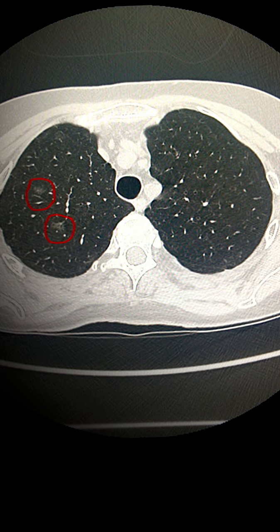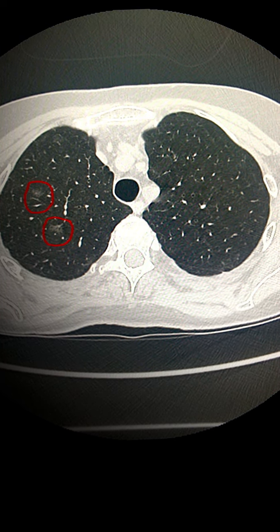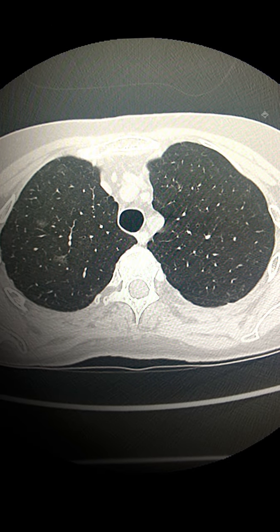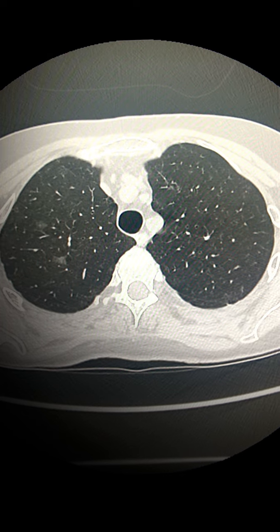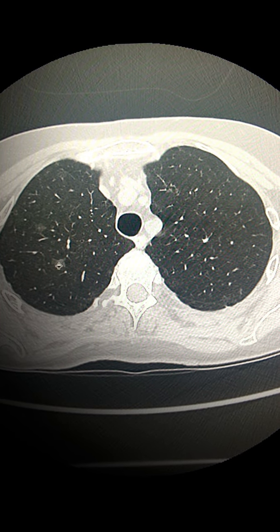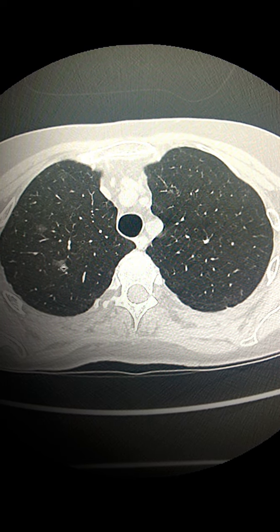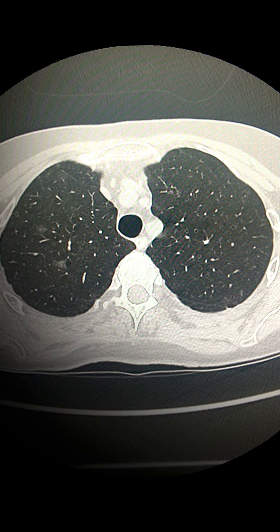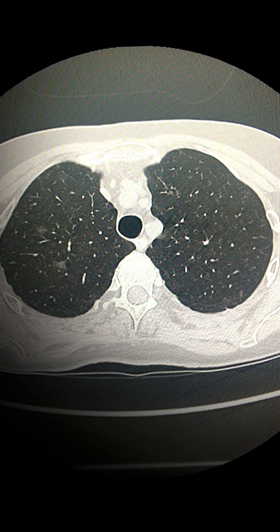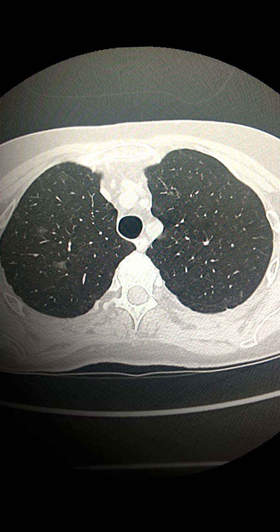The first thing to evaluate is whether they are truly ground glass density nodules or whether they are represented by en-face atelectasis. En-face atelectasis means that the region of atelectasis is facing towards you and it may actually be flat on another plane. So in order to determine whether they are true ground glass density nodules and whether they have a volume instead of a flat appearance, we have to change the plane. We are going to change to the coronal plane in this case, and we can see at a matching position that these do represent distinct nodules rather than en-face areas of atelectasis.